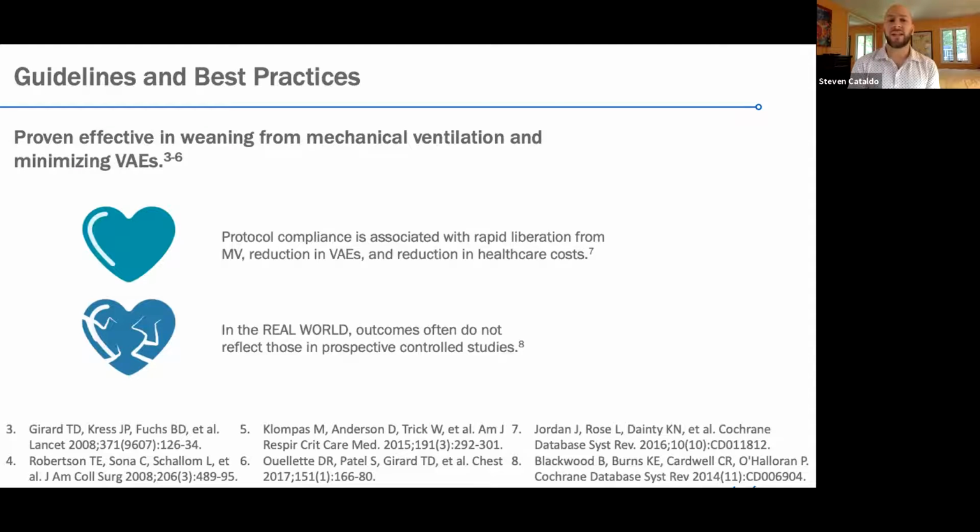So what has been done, and what is current practice looking like? All right, there's a lot of different protocols and what we call guidelines and best practices that are out there. You're looking at CHEST, you're looking at AARC, a lot of these big organizations putting out best practice guidelines and protocols to effectively minimize the length of time on mechanical ventilation, and minimize the incidence and prevalence of ventilator-associated events.